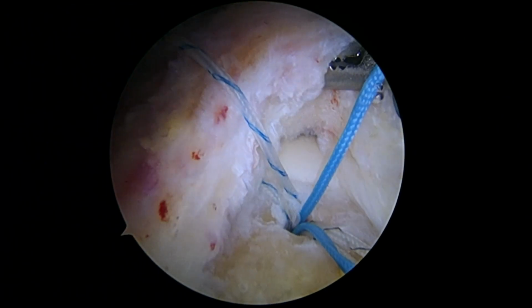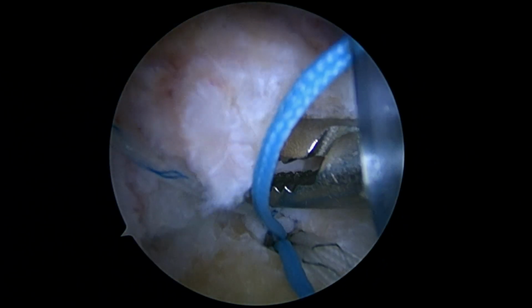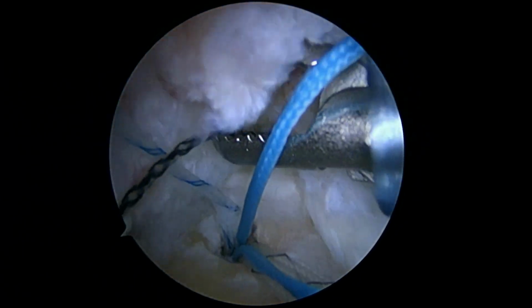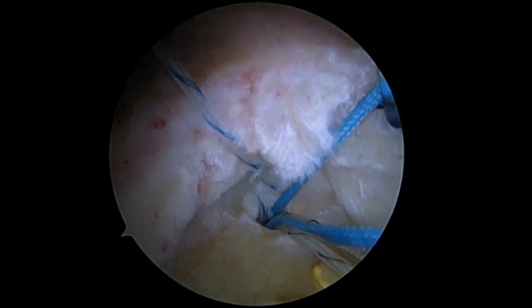Push in a little bit. Straight. Yeah. Okay, that's good. There we go. You just push through. You have a good strong tendon, so we'll grab the relay here. Pause.